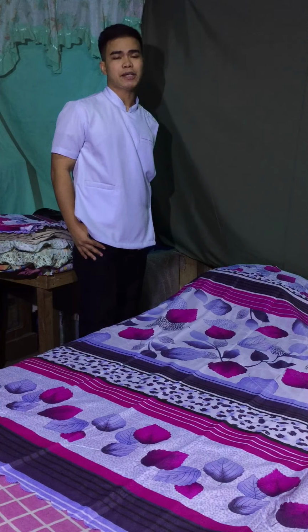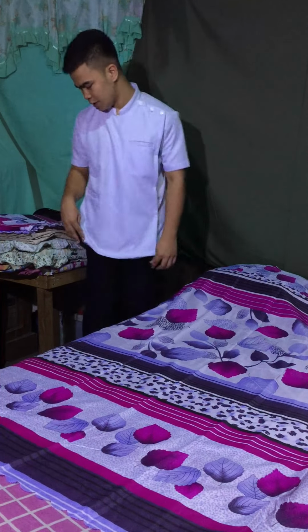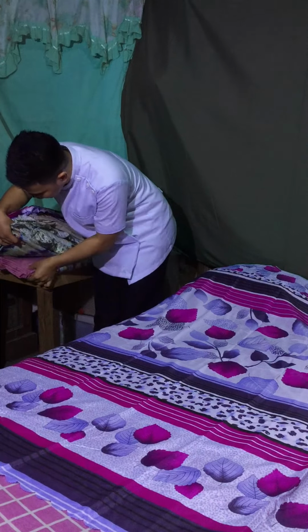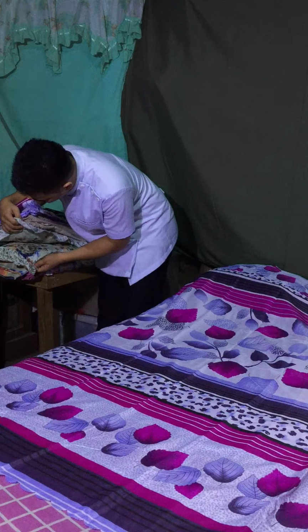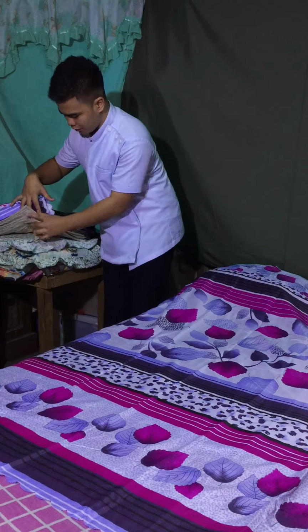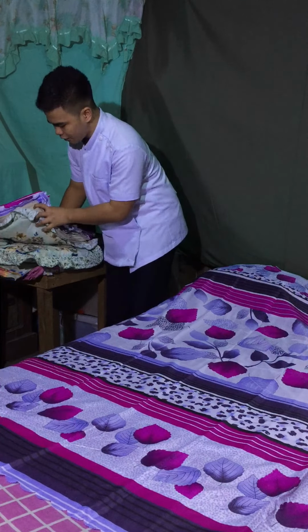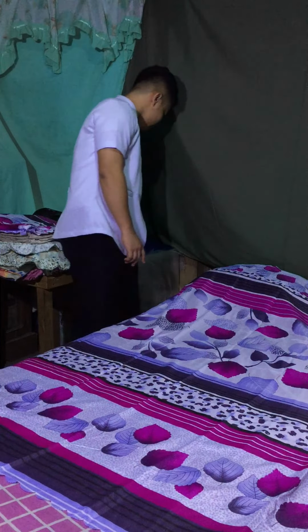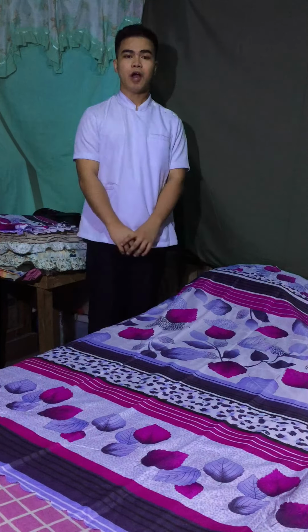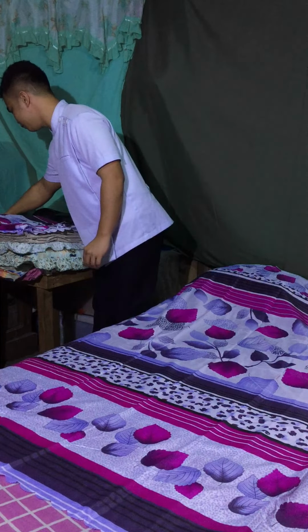So prior to the conduct of the procedure, I am going to provide the equipment. So we have the bottom sheet, the absorbent pad, the pillow and the pillowcase, the top sheet we have here, the blanket also, and the draw sheet. Then we have the hamper, this one, the hamper, also gloves. So we have here the gloves.